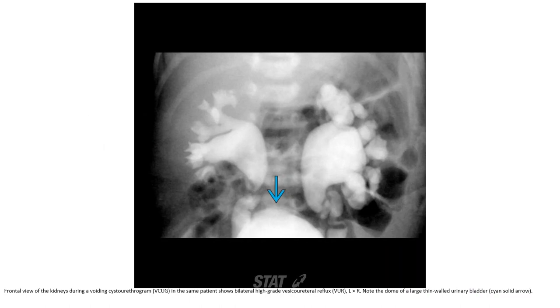Frontal views of the kidney during voiding cystourethrogram in the same patient showed bilateral high-grade VUR, left more than right. Note the dome of the large thin-walled urinary bladder.